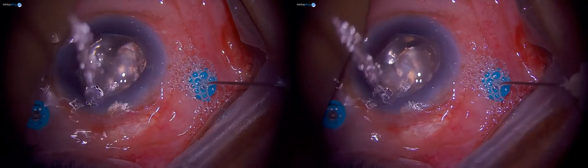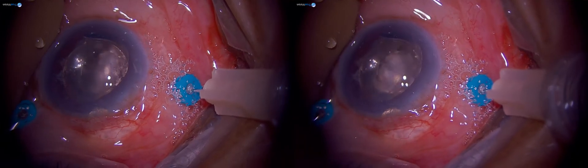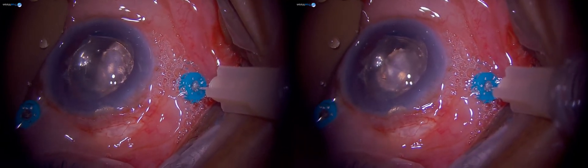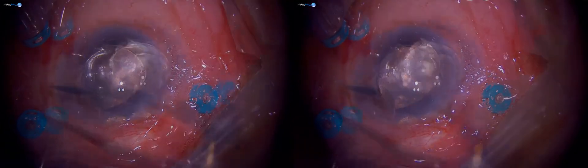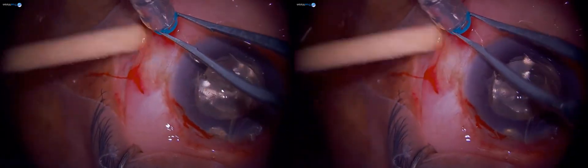You've demonstrated a lot in this case — being gentle with the tissue and ensuring good visualization. Why are you doing an air-fluid exchange on this patient? I basically do an air-fluid exchange at the end of all my vitrectomies. It's a partial exchange, mainly to have an air bubble to keep the wounds secure. In sutureless vitrectomy, with saline inside the eye the wounds can be a bit leaky.